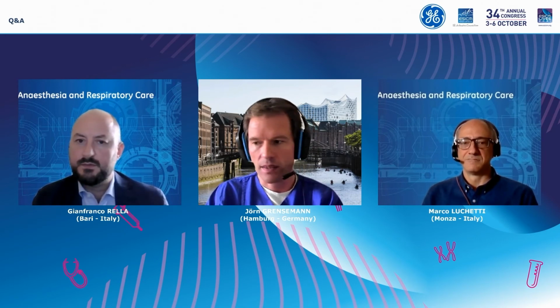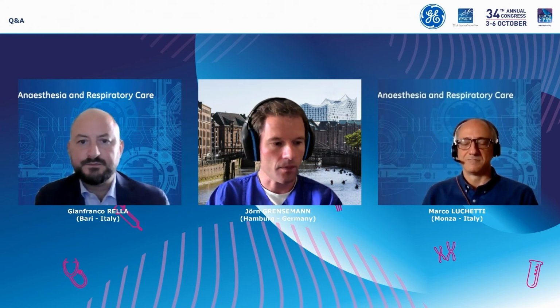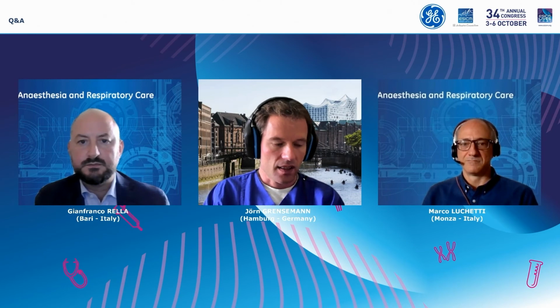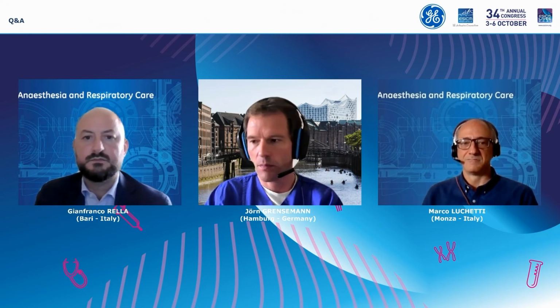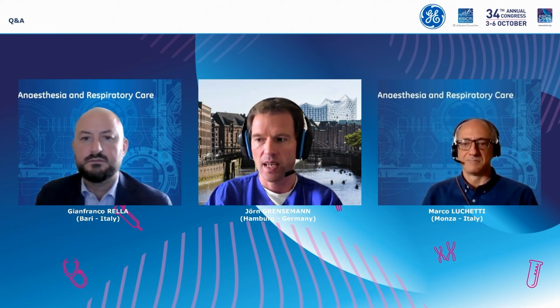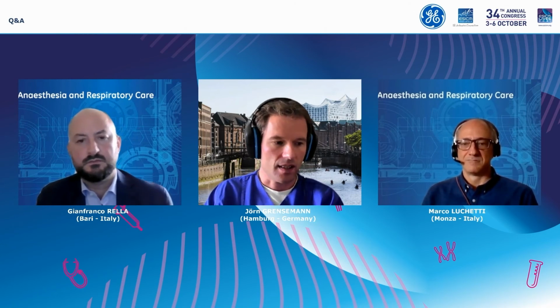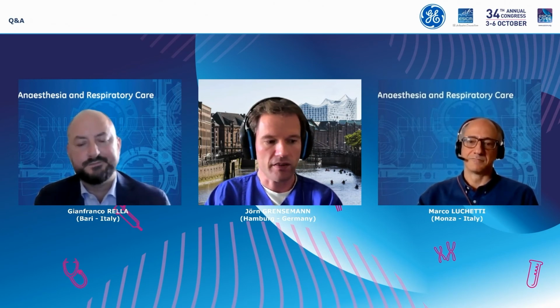Now, there are some inherent limitations because you do not get the pulmonary circulation. It's always excluded from the energy expenditure. So I think, well, if you insert pulmonary artery catheters on a regular basis and you do not have indirect calorimeters, it's better than formulas, but still it does not meet the precision and accuracy of indirect calorimetry.